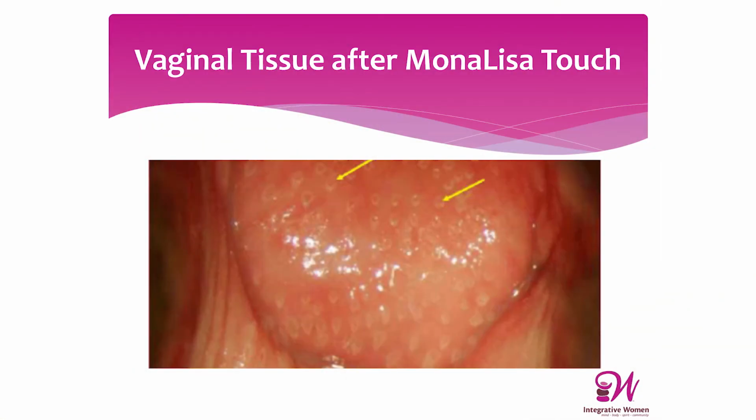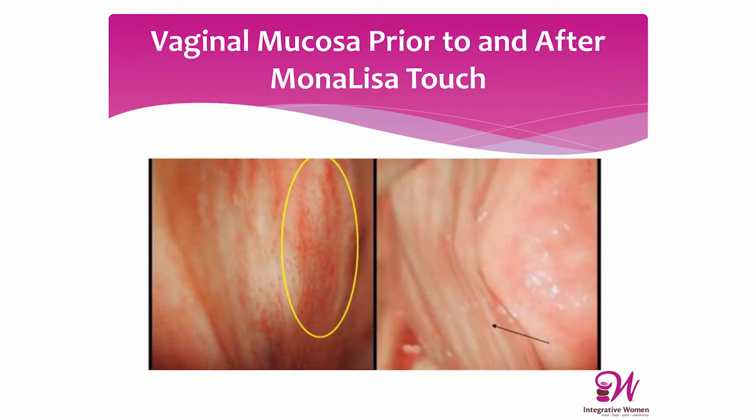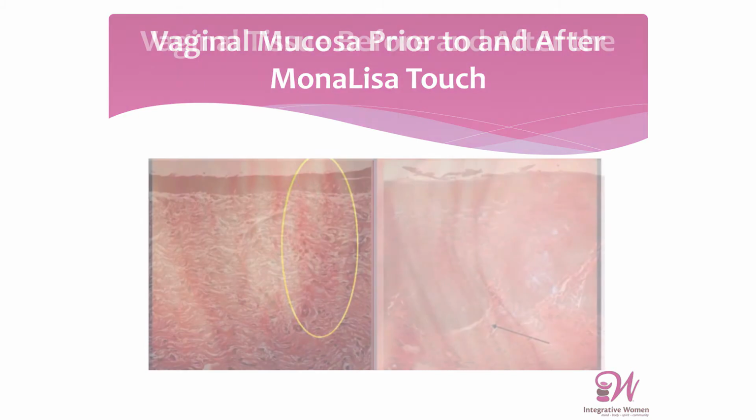And the next slide shows what the vaginal tissue looks like after you've had a MonaLisa treatment. And those little white areas are just the little ablative regions. Again, this is the same patient. The first slide here, you can see that there are no rugal folds. It's completely flat. There's no secretions. The area that's circled is petechiae, and that's actually trauma. But again, this next slide is that same patient. Increase in those rugal folds, lots and lots of secretions.